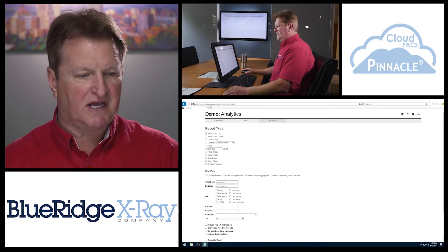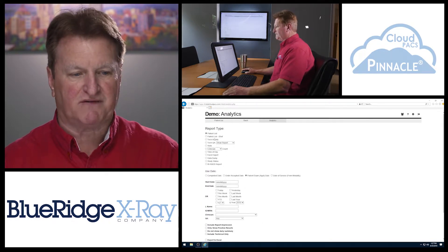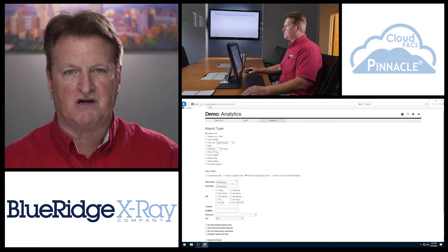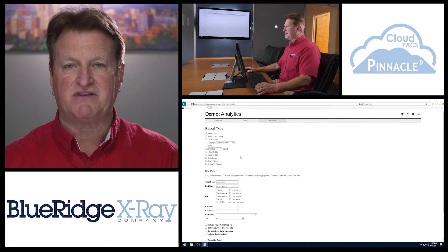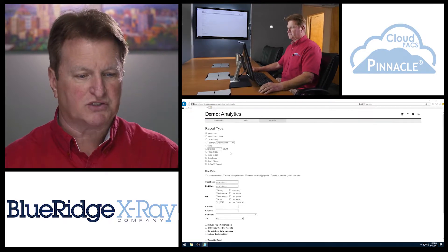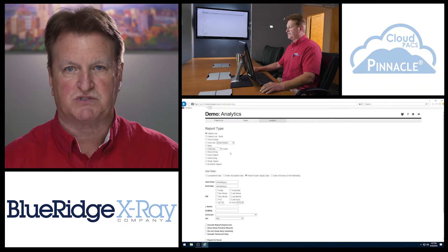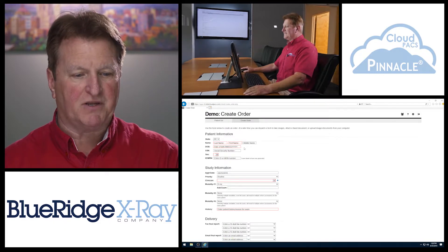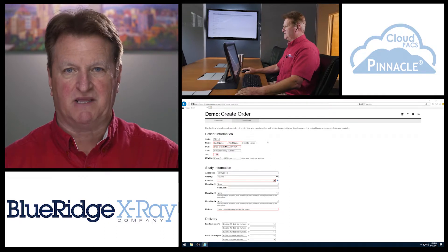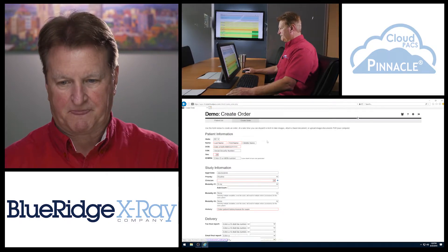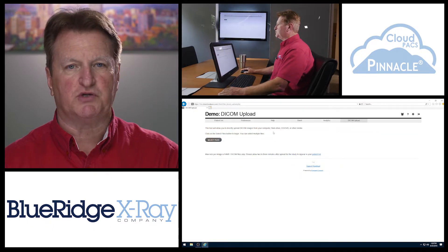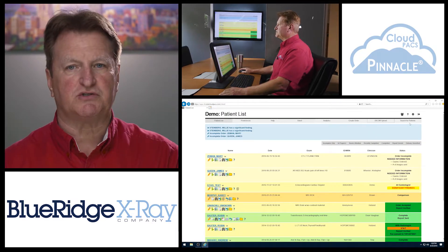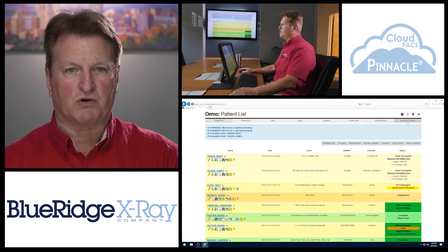The analytical screen allows you additional features of filtering as well as tech QA, image quality review, review of utilization by provider and by exam, and even time of day to determine if there are certain times that more studies are done than others — to help with staffing. Creating orders is the screen where you can attach any type of document along with the DICOM image. The DICOM upload screen is what you would use to burn a CD. The search for patients allows you to search by name, ID number, or date.